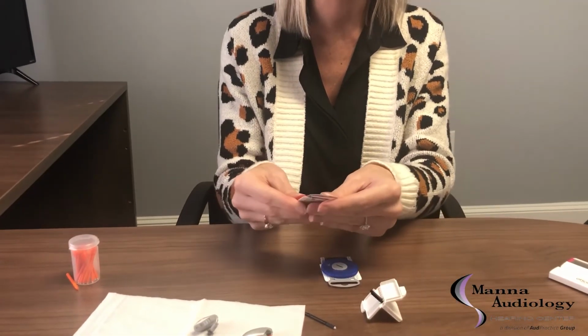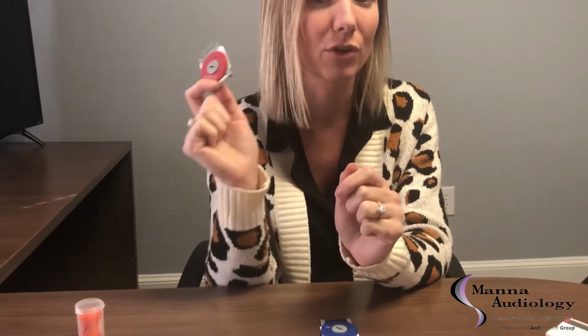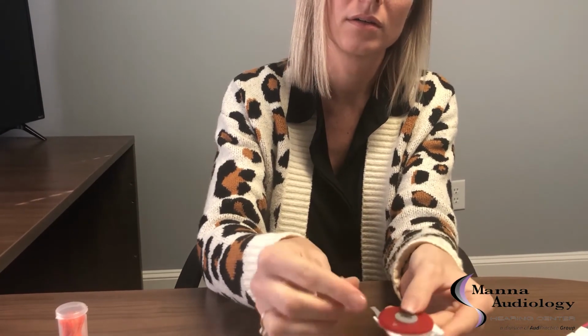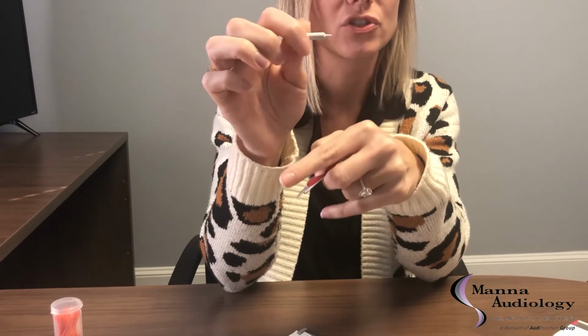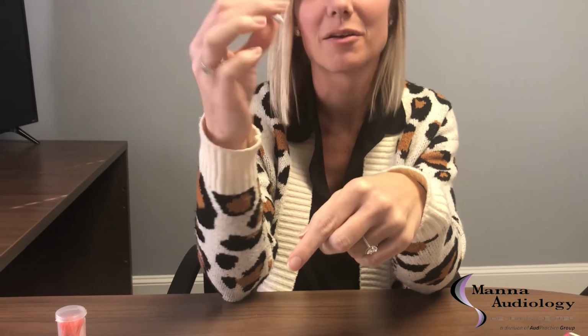So these ones specifically are for the Signia custom hearing aids. Red is for the right ear, blue is for the left ear. And all you would do is take off the tool at the bottom. So you're going to pick up the new filter, just like that. You can see the red on the end there. You're gonna put the other side, you're gonna screw that into the custom hearing aid, take out the old filter, flip it around, and put the new one in. Ta-da!